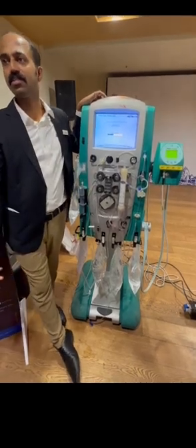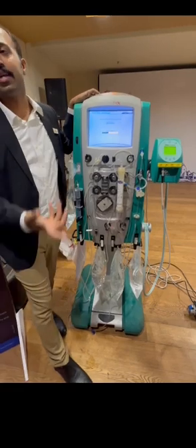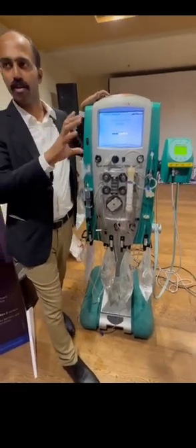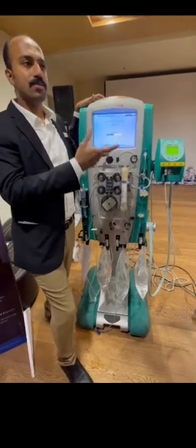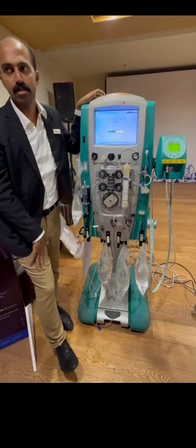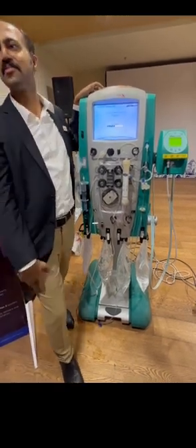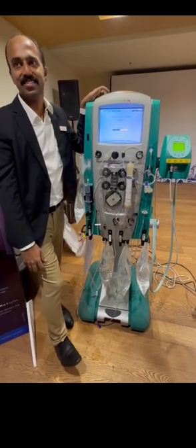Okay, if the patient is not hyperkalemic, almost all patients are hypokalemic, that's where the CRRT is. So in the protocol we can add 10 ml, that is 20 milliequivalent in each bag. So 20 divided by 5 liter, we will get 4. And also, it is not easy to bring one more solution to it. Okay. So that is the reason.